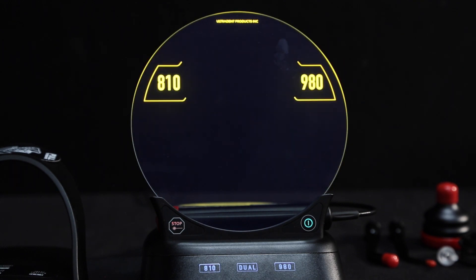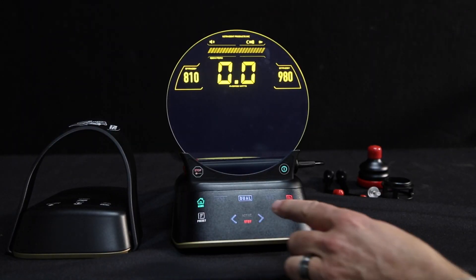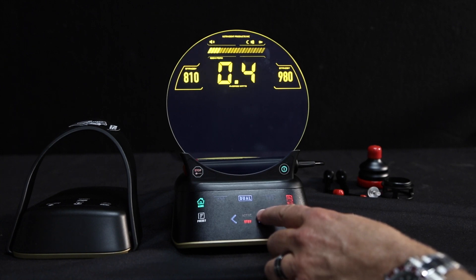After selecting your wavelength, you can input the average watt setting to start cutting if you know the settings you need to use. Select Active, then depress the foot pedal.